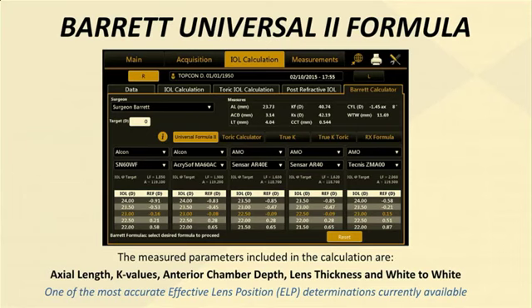And if you look at, again, the latest publications, like I said, Melles, Ophthalmology 2018, we see that the Barrett shines amongst all ranges of eyes and axial lengths. So very useful, but you just see the different tabs can be selected based on what you need. And our techs are trained to do this.